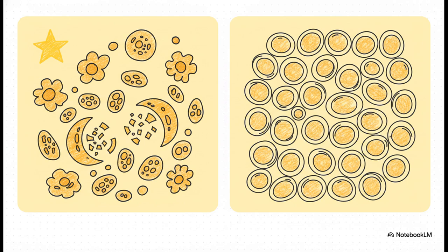And this perfectly illustrates why those macrophages matter so much. In a typical reactive hyperplasia, you've got a really busy mixed neighborhood. It's polymorphous, full of totally different cell sizes, and loaded with tingible-body macrophages, just cleaning up the streets. But contrast that with a malignant follicular lymphoma. Notice the stark difference? It's a completely monotonous, cloned population of centrocytes and centroblasts. It totally lacks that starry sky appearance, because those malignant cells have basically stopped undergoing normal apoptosis. It's crowded, it's uniform, and it's incredibly dangerous.